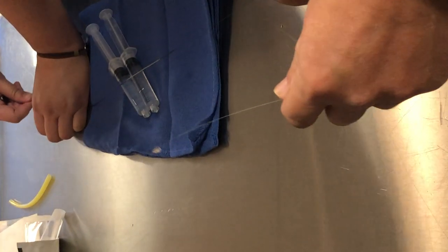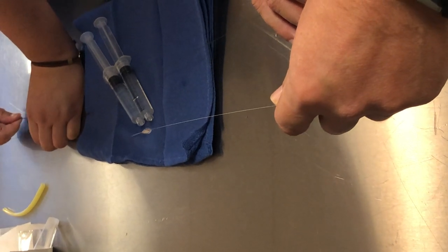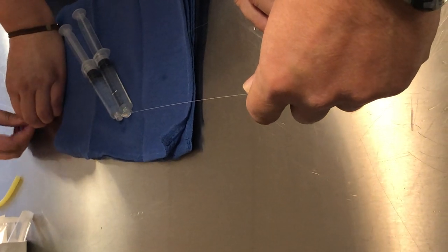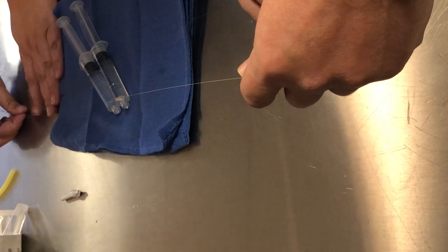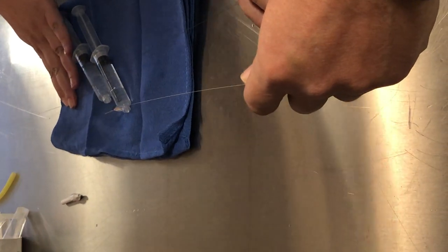We're simulating this in our carotid artery model — you will come to a hard stop right here. Take the torque device off, pin the wire back so this section is out of your hemostatic valve, and then this pulls off like that.